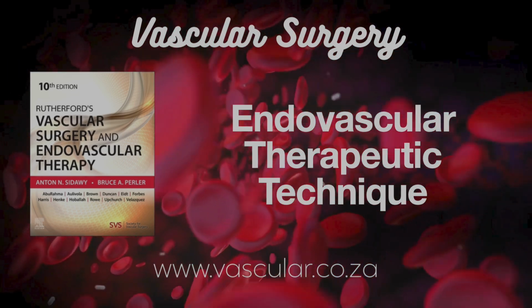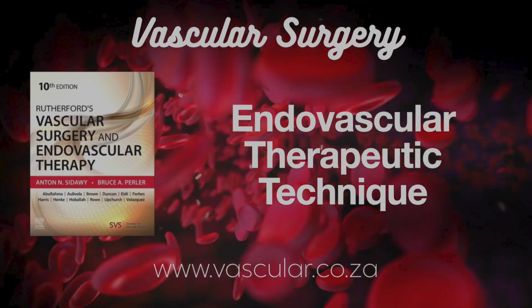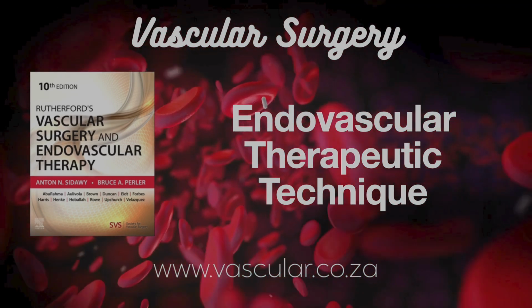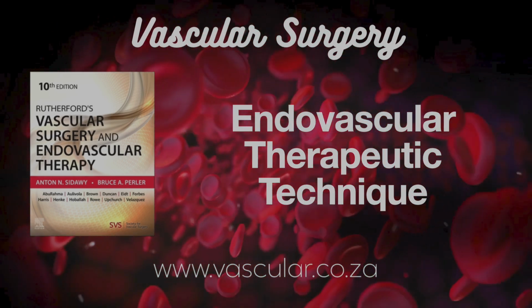That sounds promising. Did that lead to bigger trials? Absolutely. Levant 2 was the follow-up. A large, global, prospective, randomized trial. Again, Lutonix DCB versus standard PTA in the SFA popliteal. Same result. Better patency. Yes. Superior primary patency for the DCB group at 12 months.